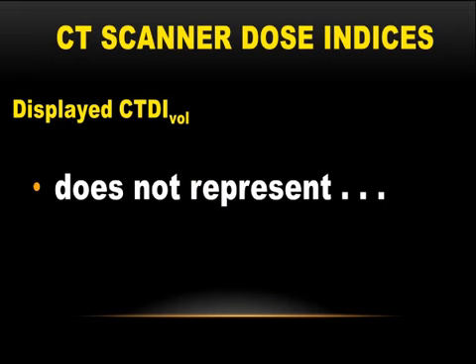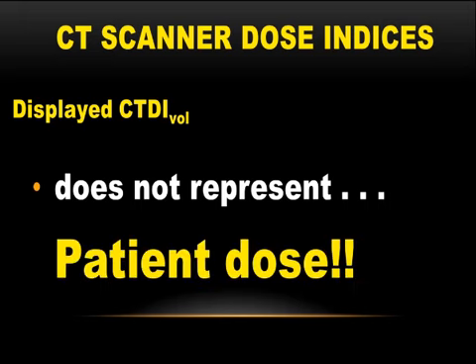But if you don't take anything else from this lecture that I give this morning, please keep in mind that the displayed CTDI vol does not represent patient dose, because there is no compensation in that number whatsoever for the size of the patient.